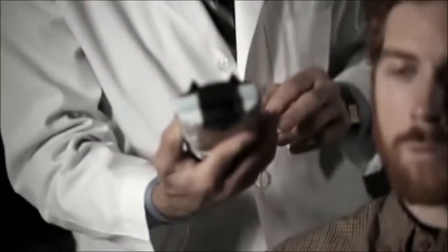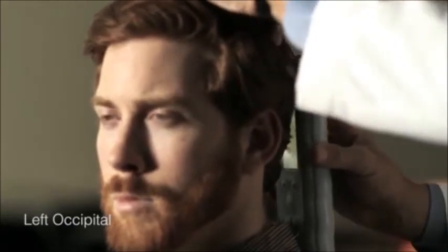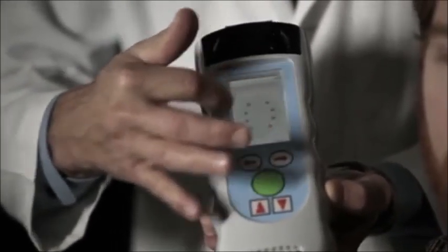So we're going to complete the last measurement in the occipital area, and we're going to select a line between the top of the ear and the back of the skull. Midway between that spot, we're going to again get through the hair, and then the same point between the top of the ear, the external protuberance of the skull, midline, and we now have an absolutely normal scan bilaterally in all 8 areas, 4 on each side.